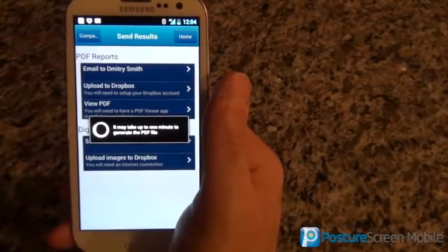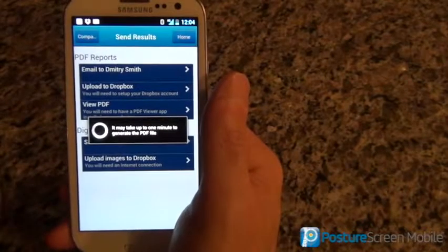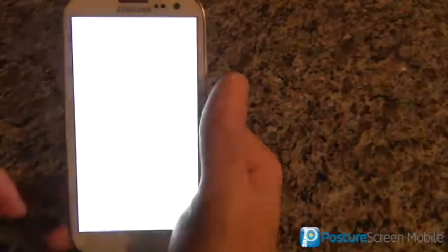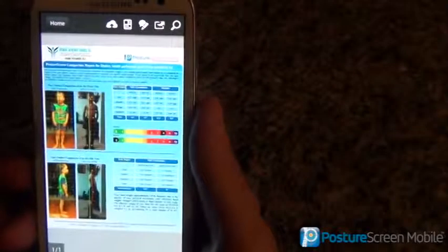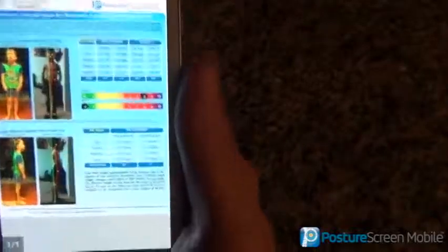This can take upwards of one minute to generate the PDF document. It's a little faster on this one. Then it's going to open up the PDF — and there it is.